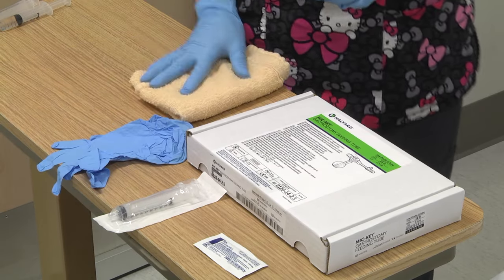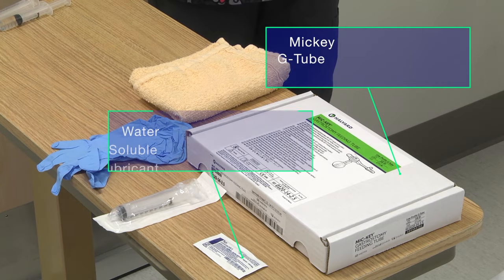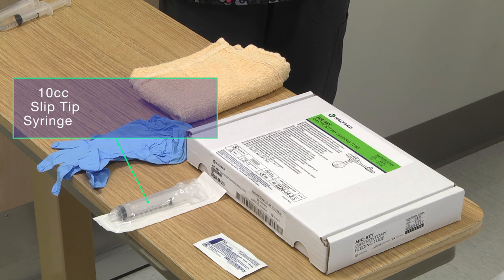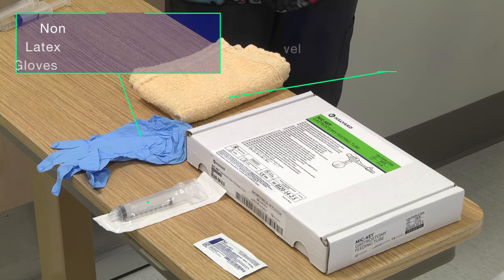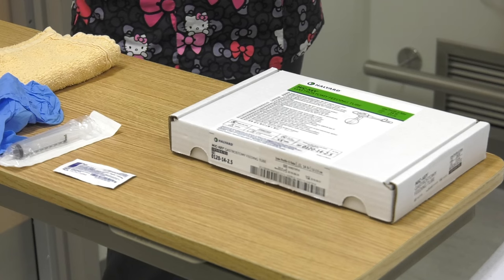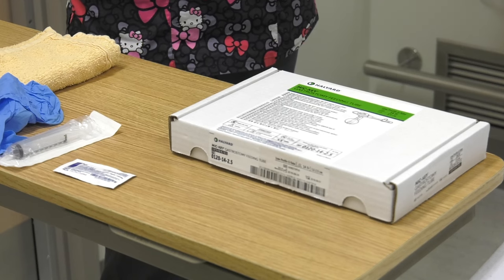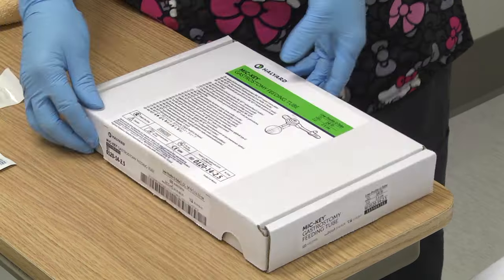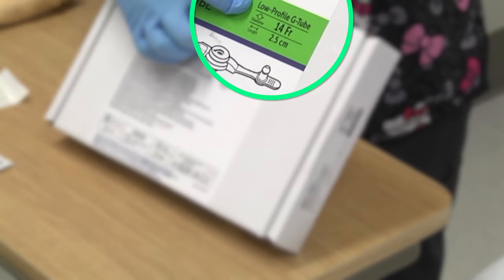Wash your hands and gather your supplies: Mickey G-tube, water-soluble lubricant, 10cc slip tip syringe, water, non-latex gloves, and a towel. Wash your hands and put non-latex gloves on. Gloves are only required in hospital settings.